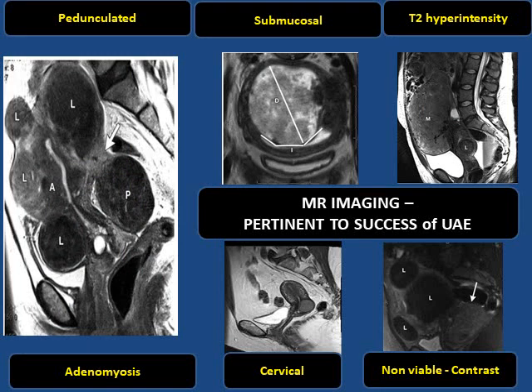Twisting and narrowing of the pedicle will lead to accessory procedures. But now it has been clearly proved that if the pedicle is more than 2 centimeters, there is less chance of this particular fibroid getting distorted. This is a large subserosal pedunculated fibroid. Here we are able to see the pedicle from here to here. This is more than 2 centimeters.